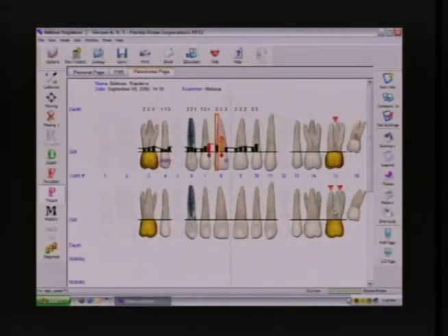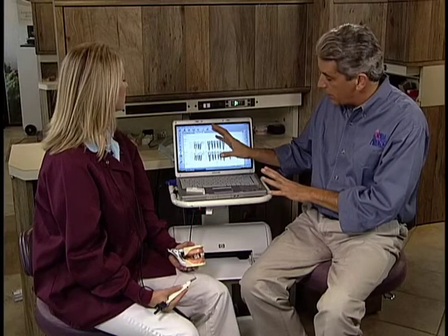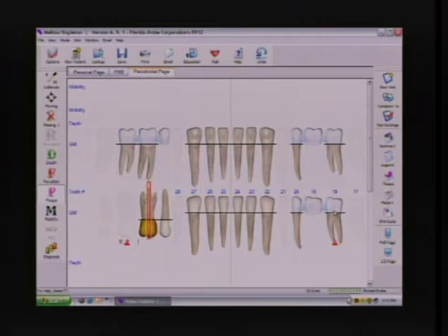Hold and listen. Plaque. Again. Plaque. Now you'll have to listen for plaque again on this one. Plaque. Midline. There you go. Very good. So we're at the end of the plaque mode. We pause as part of our strategy. If you're confident, quick tap advance.